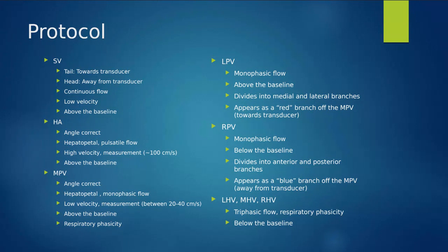And all of these are really great examples of what a thrombus can look like. This top image, I believe, is of the left portal vein. We have a clot there causing dilation of the rest of that vessel. We have a real big clot here. Oof. And then we have this monster clot extending the entire main portal vein, even going into the right and the left portal vein as well.